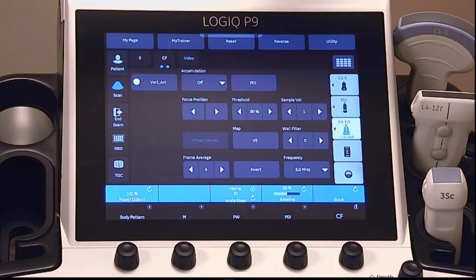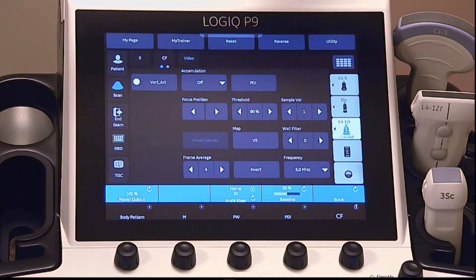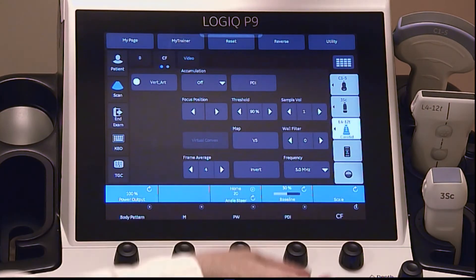The scale depicts a range of velocities that are assigned to color. Adjust the scale, or PRF, for an enhanced representation of the magnitude of the flow pattern. Increase for higher flow velocity, and decrease for lower flow velocities.